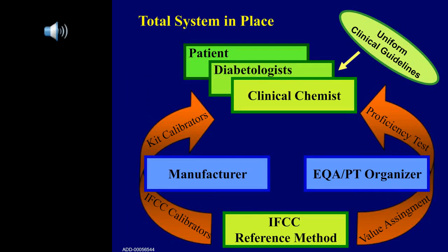The IFCC reference method at the bottom is used to assign values to the IFCC calibrators, and those calibrators are supplied to all manufacturers of HbA1c kits. And those manufacturers use the calibrators to assign values to the kit calibrators you use in your laboratory.